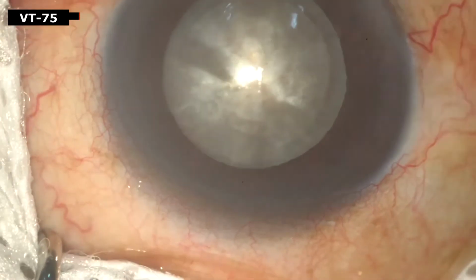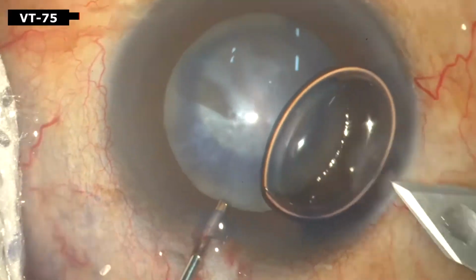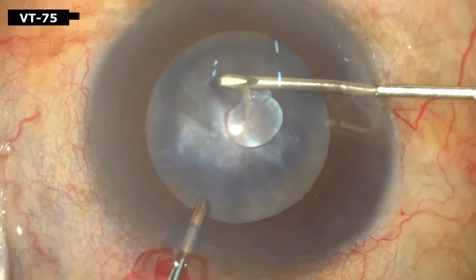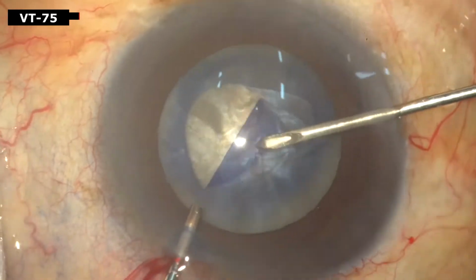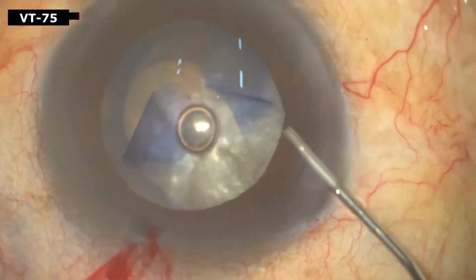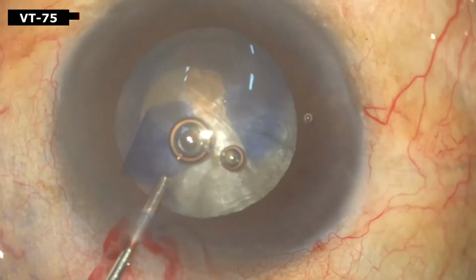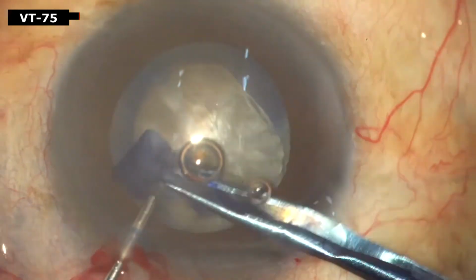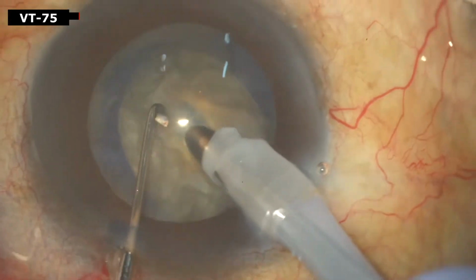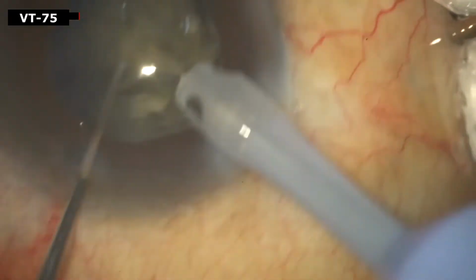This patient presented with total hypomature cataract and was taken up for topical phacoemulsification. Brilliant blue dye was injected and capsulorhexis was initiated. The surgeon used a rhexis forceps, but the rhexis extended. Phacoemulsification was started with a good direct chop. However, the tear extended posteriorly and resulted in a nucleus drop.